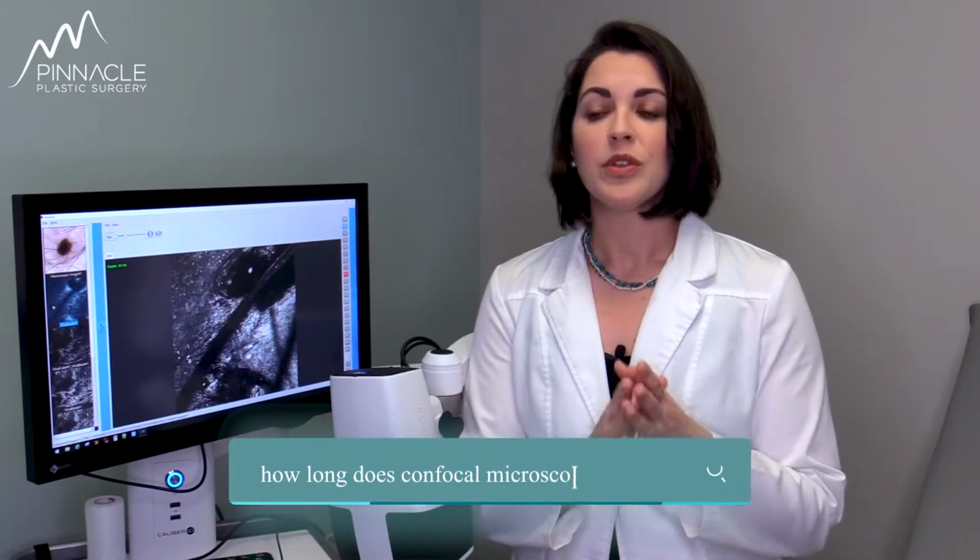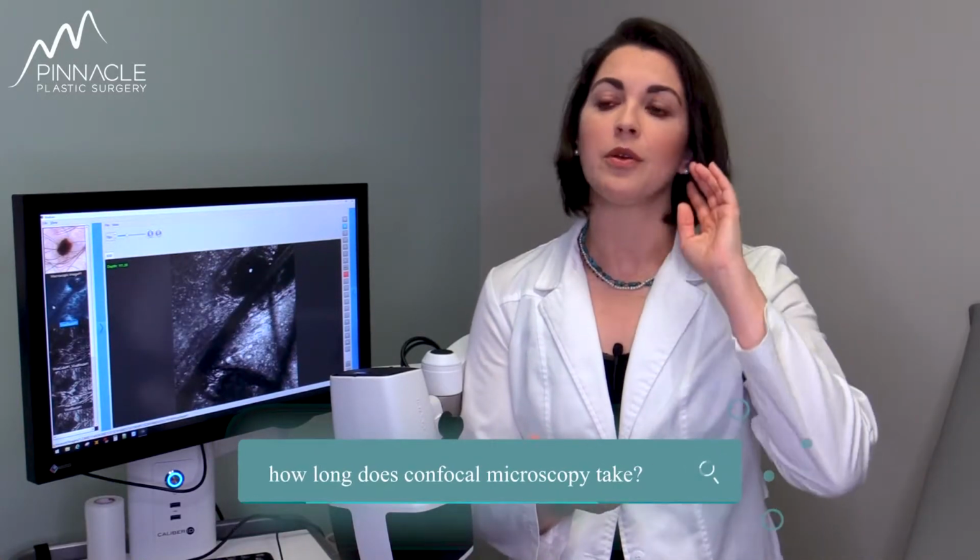Each skin lesion takes approximately 8 to 10 minutes to image, and it really depends sometimes on the size of the lesion. One of the other major benefits to this technology is that you don't have what's called sampling errors. With traditional biopsies, when you're taking sometimes a small piece of a lesion, there can be other areas of that spot that were doing something more mischievous than the spot that you sampled. That's called a sampling error. So if you have melanoma and we think it's this certain depth, but then you go and remove the whole thing and it turns out it actually went deeper in a different area, sampling error is a real thing. With confocal microscopy, there is no sampling error because you're seeing the entire lesion all the way around and all the way down.